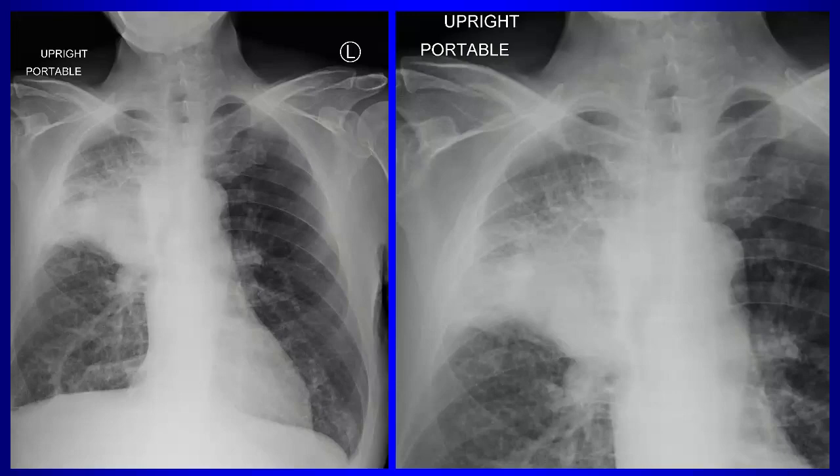If there's any abnormality in the mediastinum or the hilum, right? Especially if there's consolidation and you think there's atelectasis, you want contrast because it's very difficult to differentiate tumor from collapsed lung on a non-contrast CT scan. The rule I use is the larger the abnormality on the chest radiograph, the more you're going to need contrast to figure it out on your CT. Most people think, well, big abnormality there, non-contrast CT, be able to figure out what it is. No, it looks like a mess on a non-contrast CT.